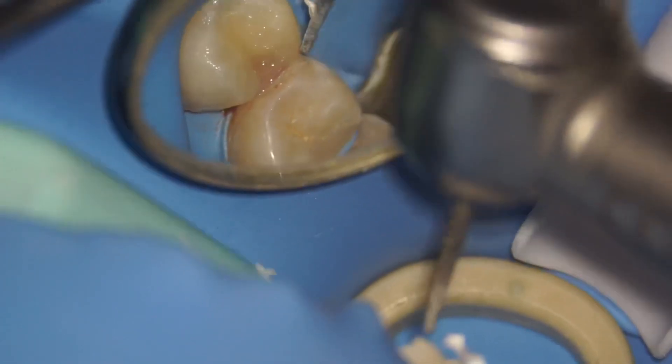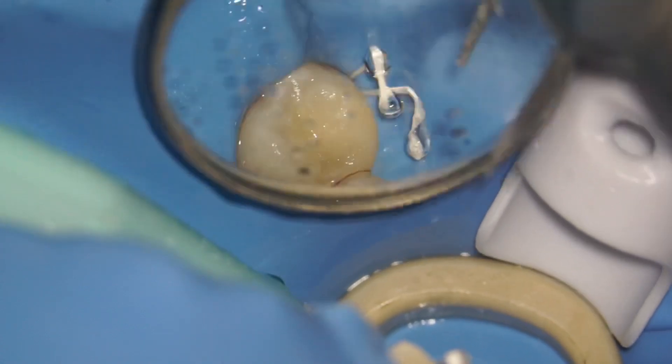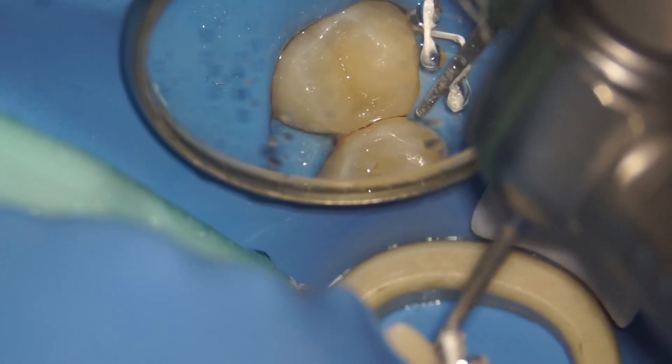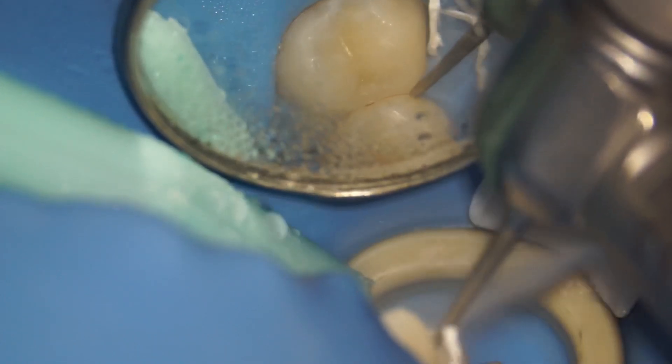I'm going to use a yellow-grid diamond bur to remove any excess. The great thing about the yellow-grid diamond bur is that it takes a lot of force for the bur to cut enamel, so when you're touching gently like this it's only going to reduce the composite instead of damaging the adjacent tooth. When you're using a microscope, you get to see that the buccal margin is not rounded.